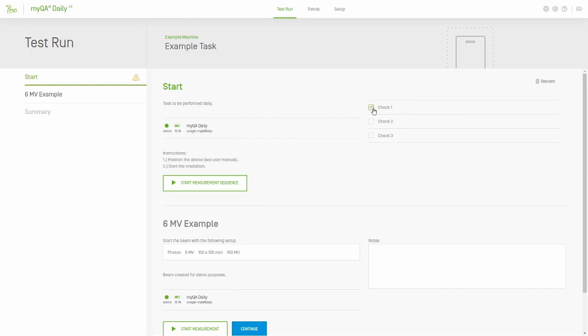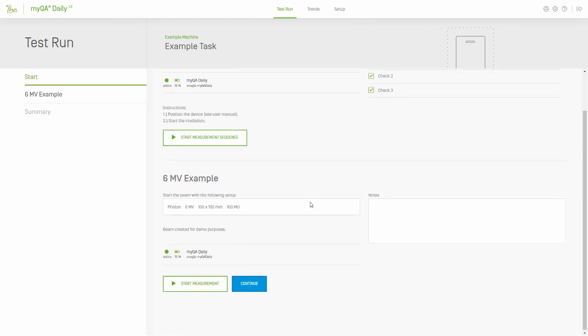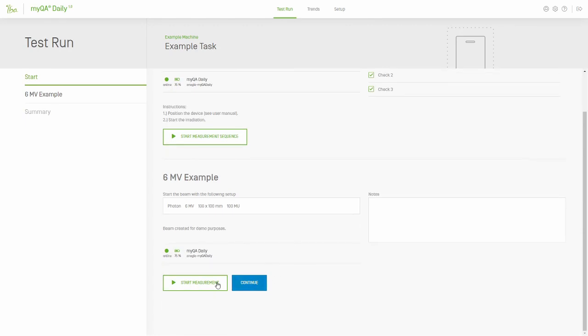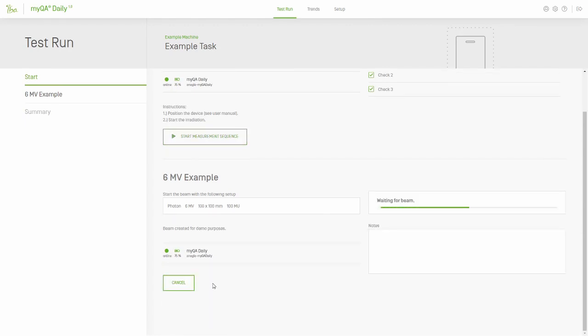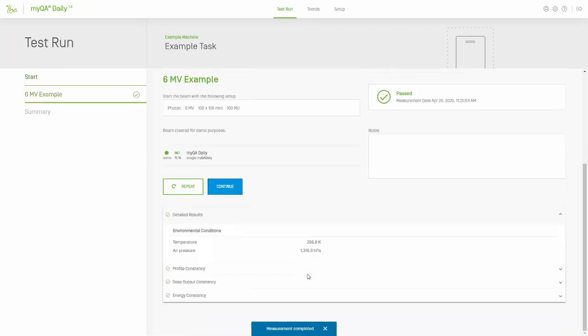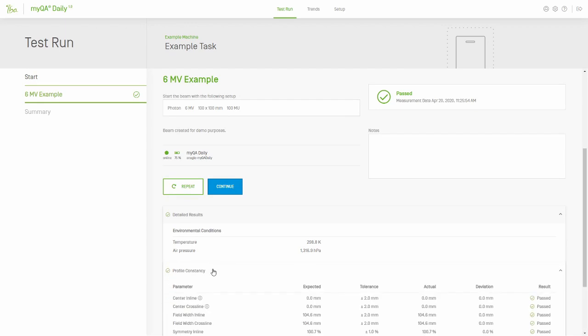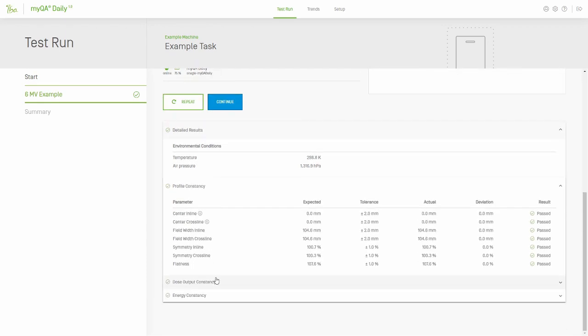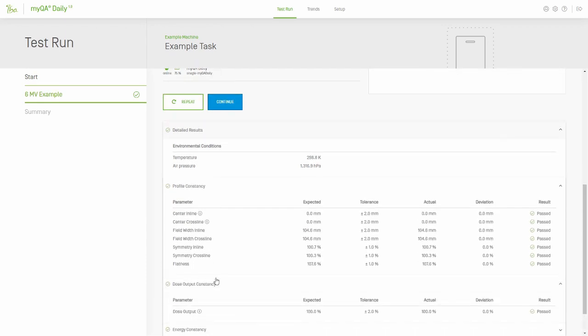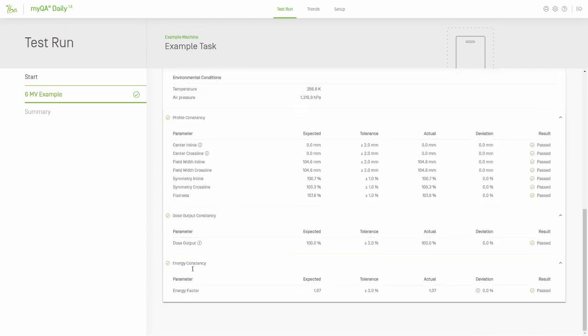The user has two options to start the measurements. First, you can click on the start measurement sequence to measure all the fields consecutively. In this case, since there's only one field, we'll use the start measurement button instead. The difference with this method is that the field results are displayed in detail immediately. The user can review the results and make any needed notes before completing the task.